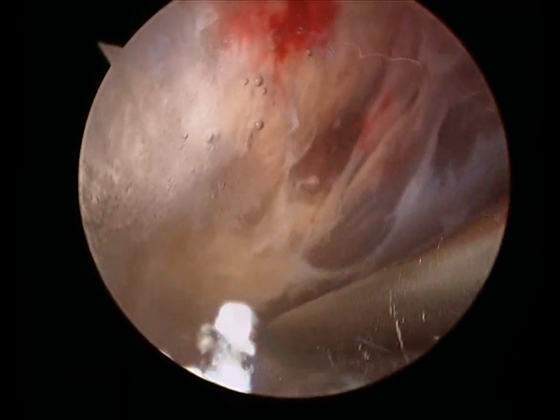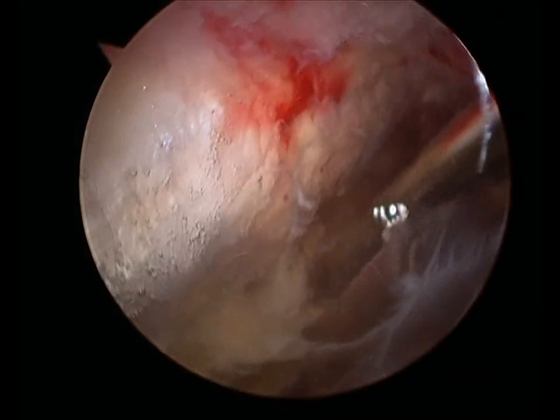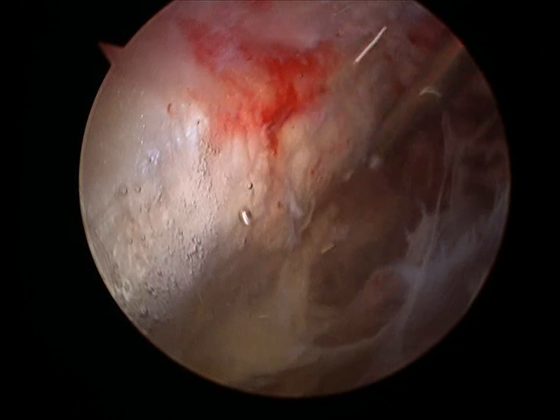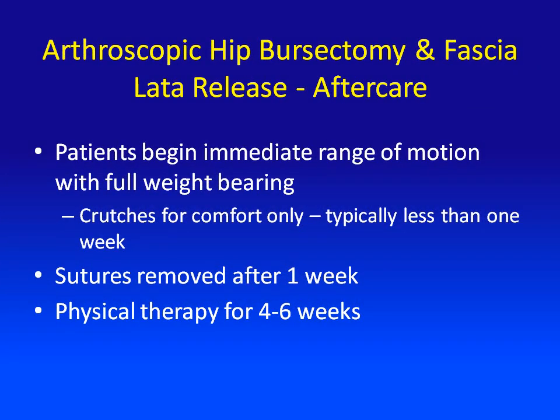Sometimes we'll find muscle tears in the gluteus medius, which can be repaired arthroscopically as well. Here you can see we're just about finished. You can see the vastus lateralis tendon on the left, and the gluteus medius tendon is on the far right, inserting on the greater trochanter. At the completion of the surgery, the incisions are closed up — usually just two or three small incisions, about a centimeter each.